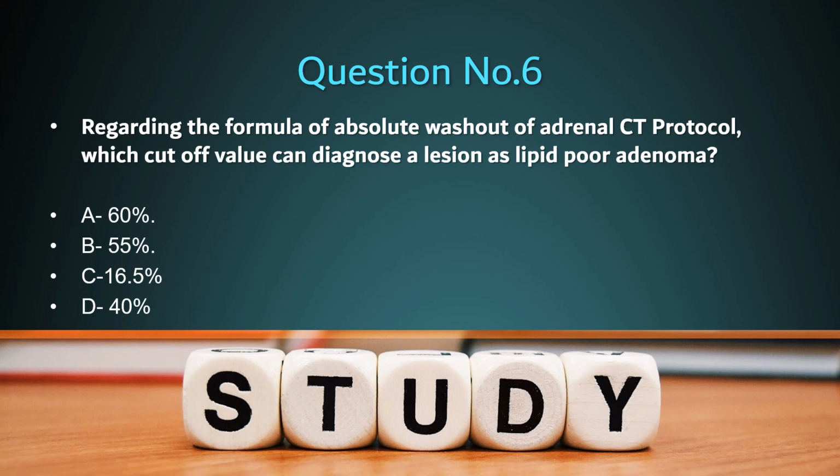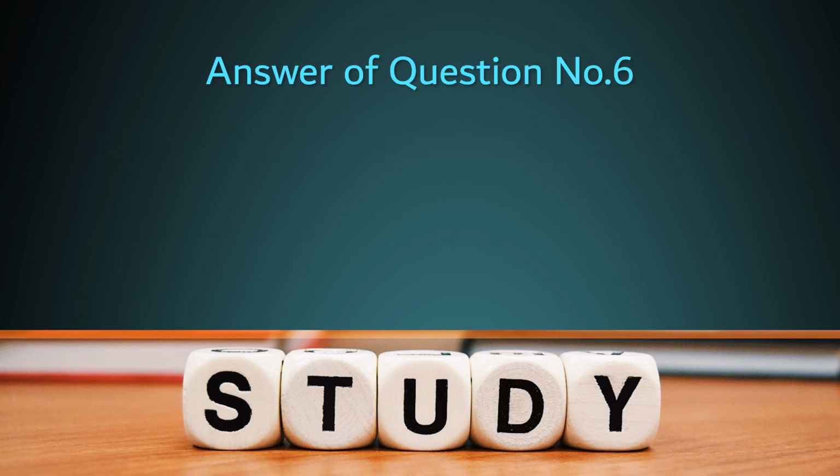Question number 6. Regarding the formula of absolute washout of adrenal CT protocol, which cutoff value can diagnose a lesion as a lipid poor adenoma? 60%, 55%, 16.5%, or 40%? The answer of this question is choice A, 60%.